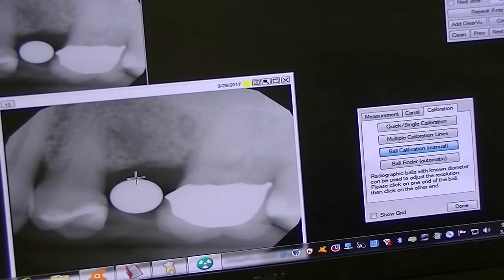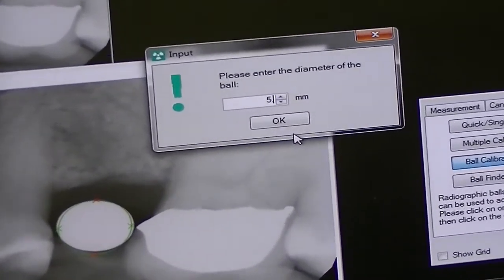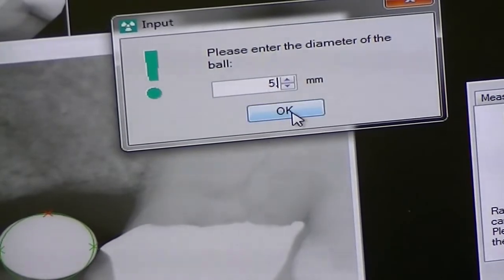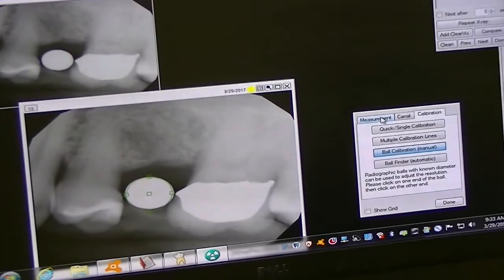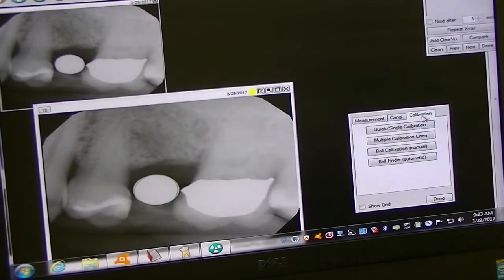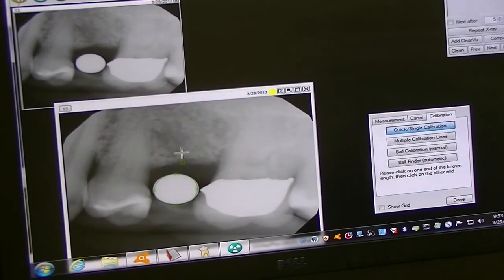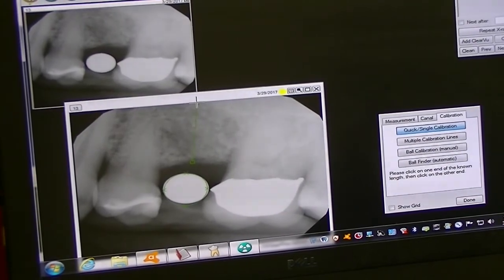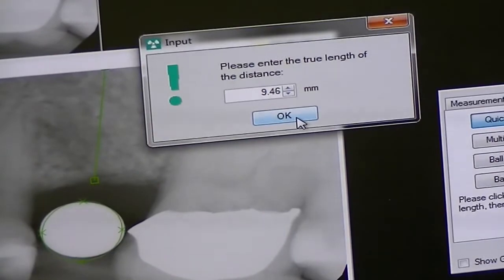It will ask us what the diameter of that ball bearing is — we'll say five. We'll say okay. Now we have a direct relationship. We'll then do a quick calibration of a single site, and we can determine how much vertical height we have. Going from the crest to where I think the floor of the sinus potentially is, you can see we have almost nine and a half millimeters of bone available.